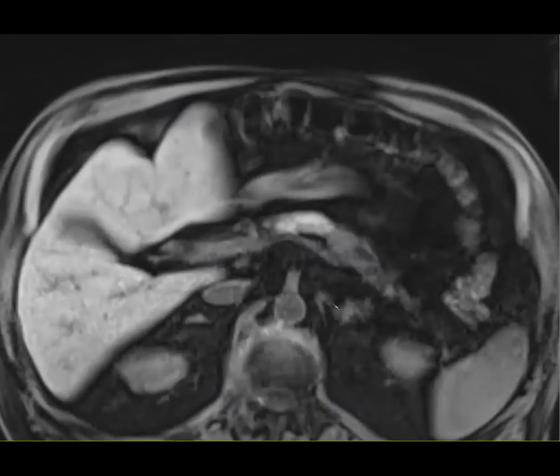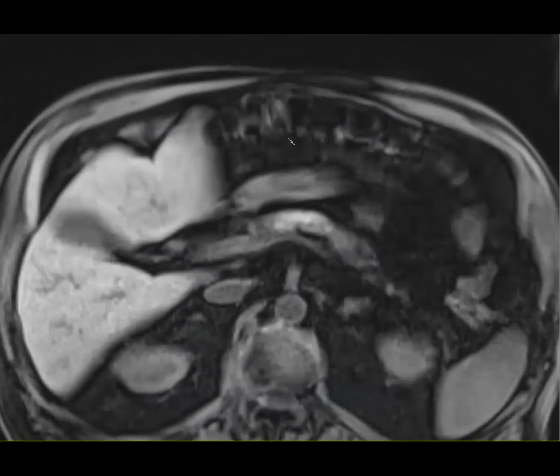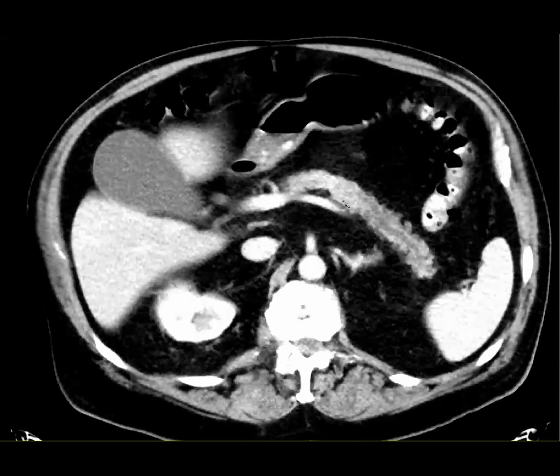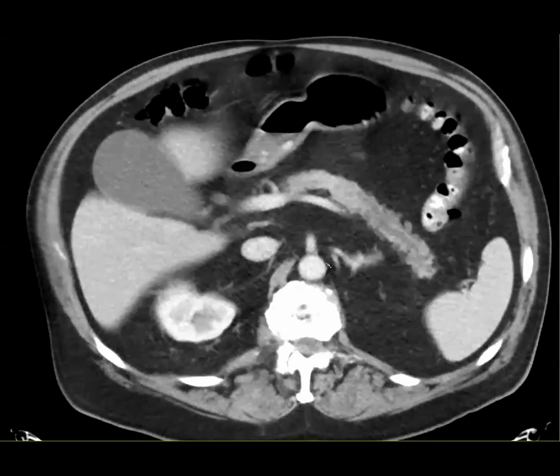Oh, wow. So this was a good incidental pickup, and it's still resectable. In this area, they could basically just do a distal pancreatectomy. It's not involving any of the vessels. So this is a great location for it, but the symptoms would present later because it's not obstructing, causing jaundice or anything. So it's good that they caught it at this point.